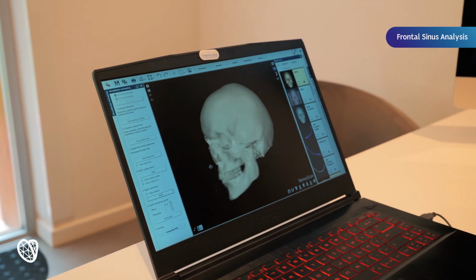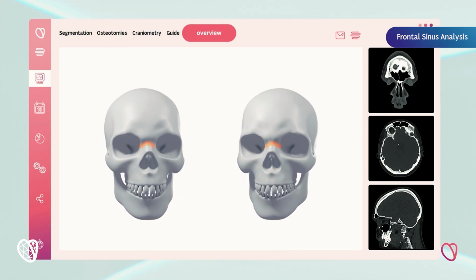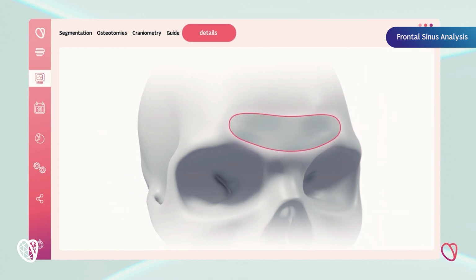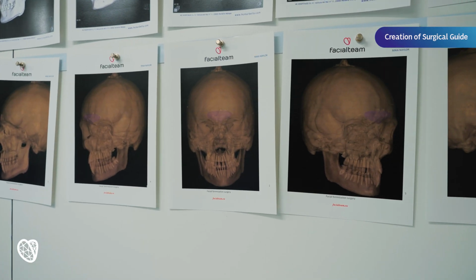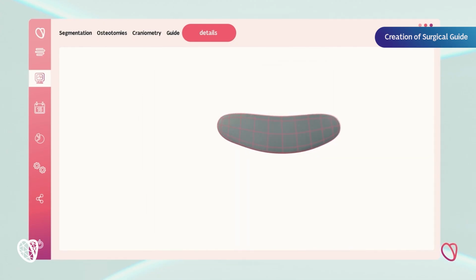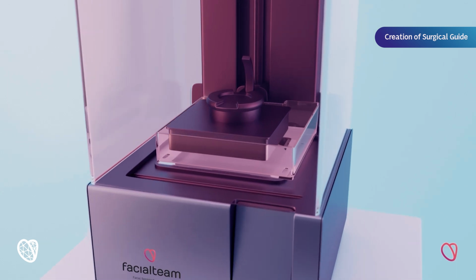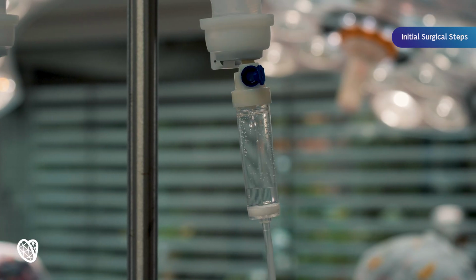Once we have all the data within the software, we analyze and measure the frontal sinus structure. We measure volume, we measure extension, we measure projection, and we base our planification on all these measurements. With all these measurements, remember projection, lateral extension, volume, air cavity, now we can create the surgical guide. The surgical guide will allow us to precisely cut the anterior wall of the sinus. This guide will be printed and now is with us in the operating room. Now we are ready for surgery. Let's go.